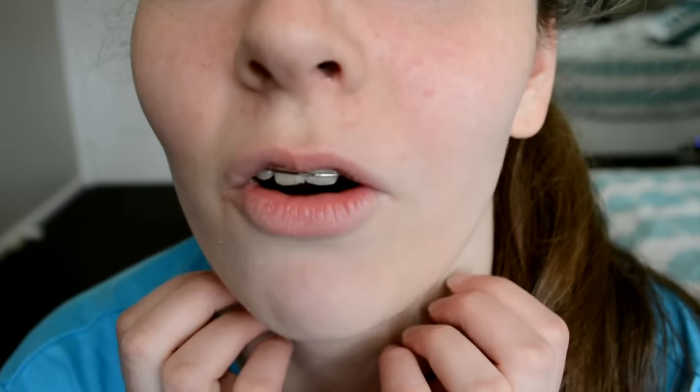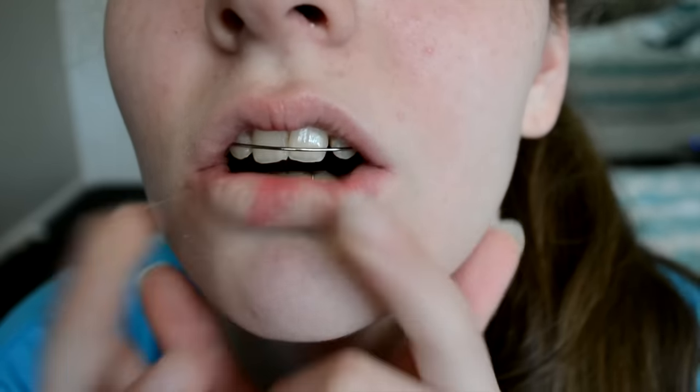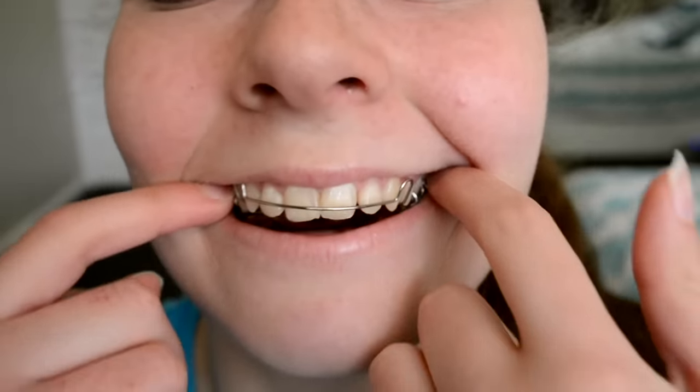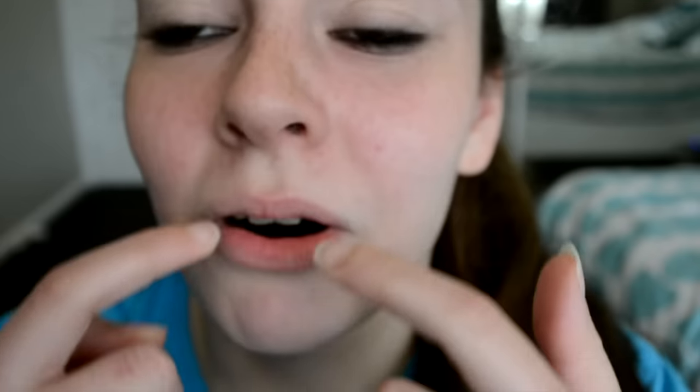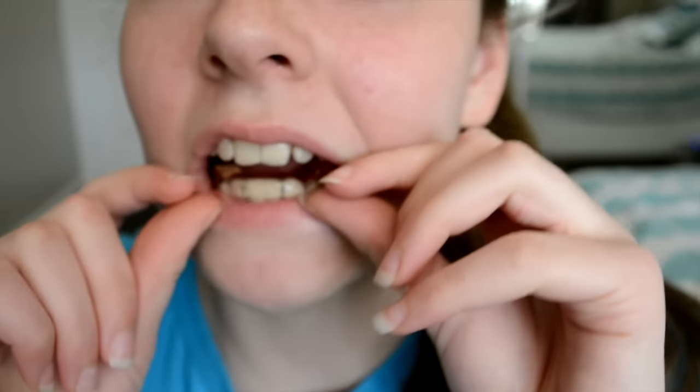I'm going to get braces soon. So this is what my mouth looks like up close. It's got a little thing and then it's got wires that go down into your gums, or wire up the top. The way that you take it out is you put two fingers back here and then you pop it out - and this is a plate, guys. And then with the other one, you just get your two thumbs and you pop it out like that.